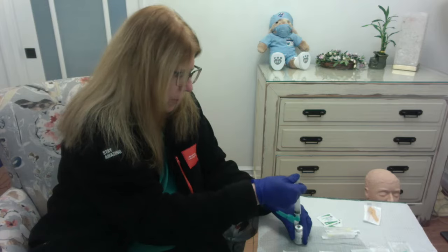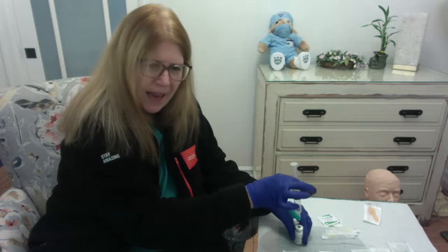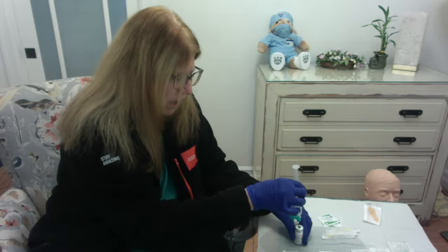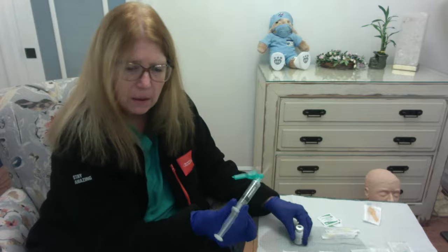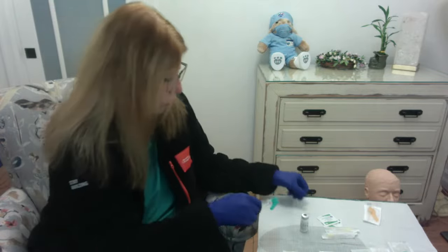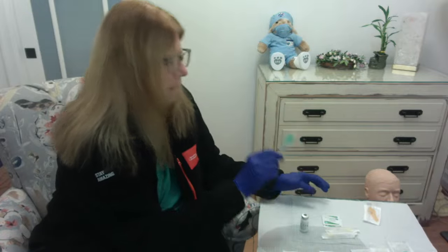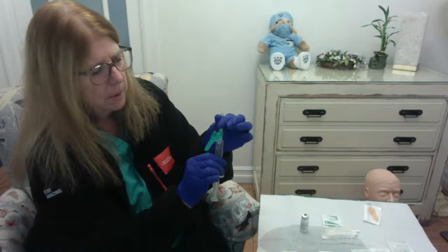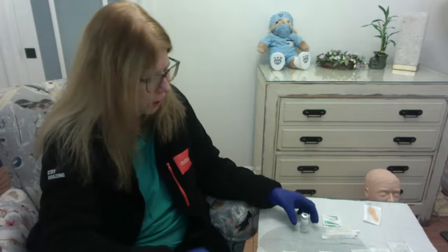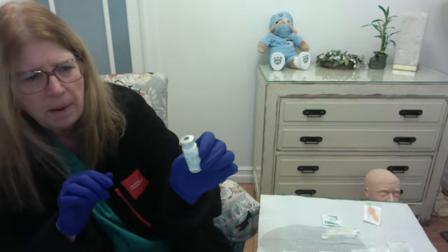Okay, I'm going to pull the needle out, not all the way out. I'm going to let the plunger come back so that the air can come out of the vial before I take my needle out. Then I'm going to safely recap this needle. Okay, one-handed. Snap it back in place. I'll put that to the side. And now my diluent is in here with my powder.